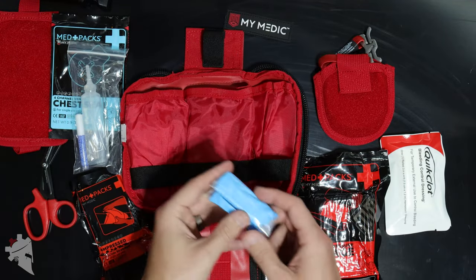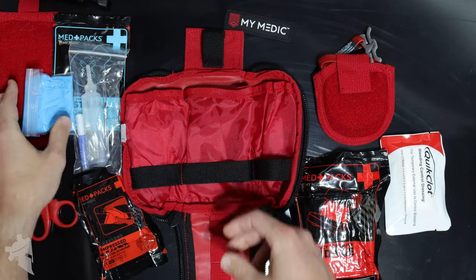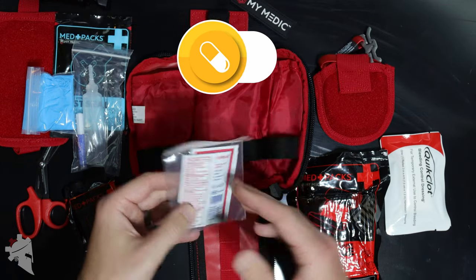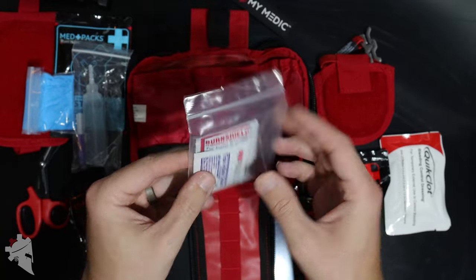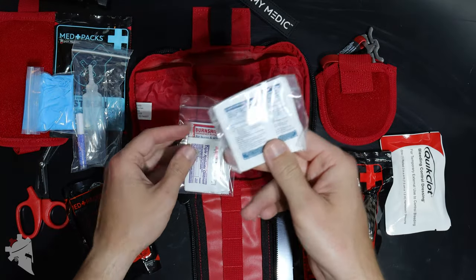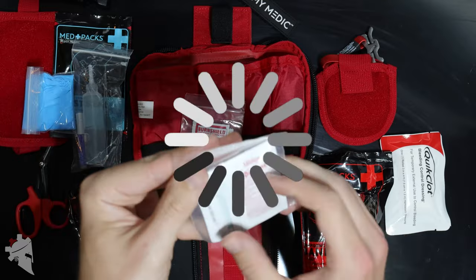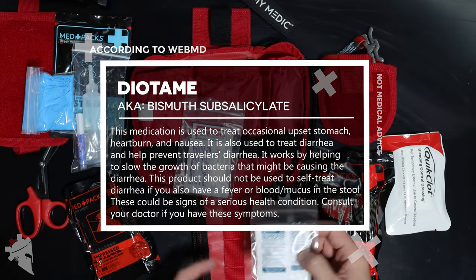Up at the top in its own little band there's a small zip-lock bag with a pair of gloves. On the left side is where you get into the less serious situations. Most medical issues you'll encounter on a range are going to be things like upset stomach, diarrhea, or a headache. This comes with ibuprofen, Advil, and Diotame — all your 'I don't feel so great' medications, which is nice to see in a kit like this.